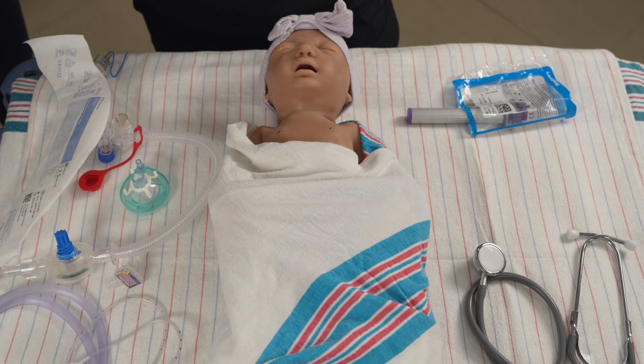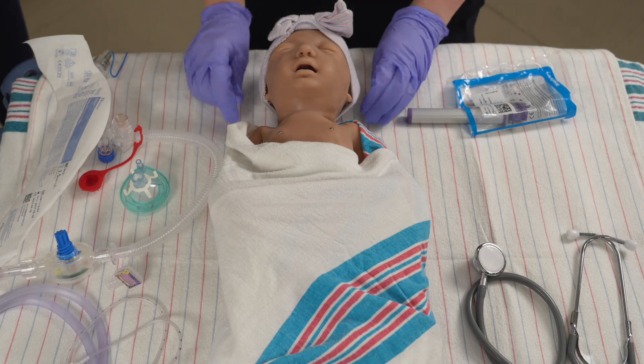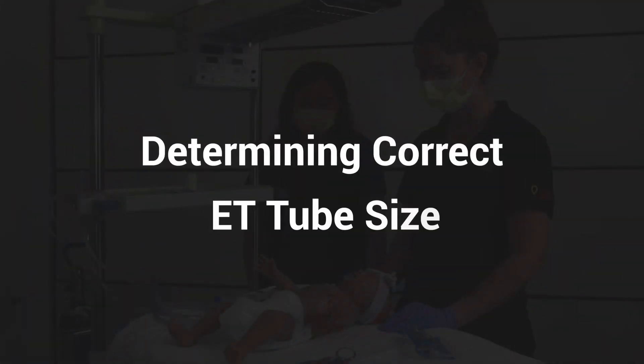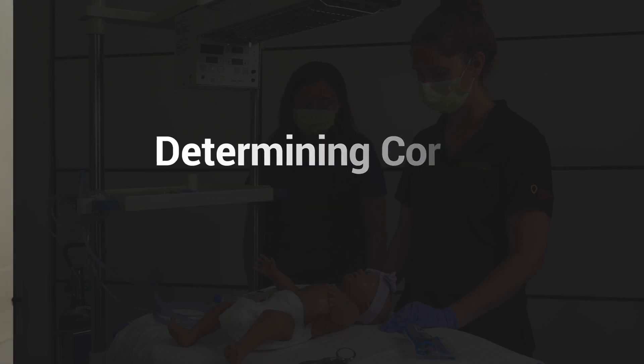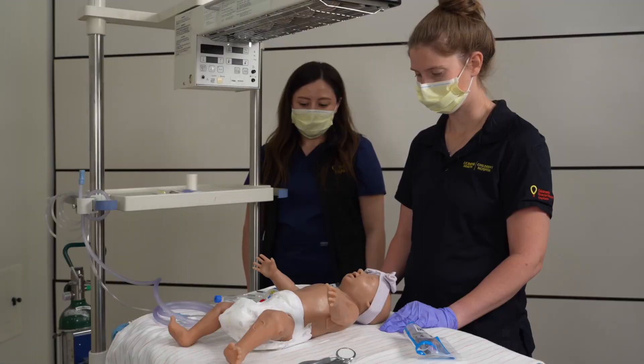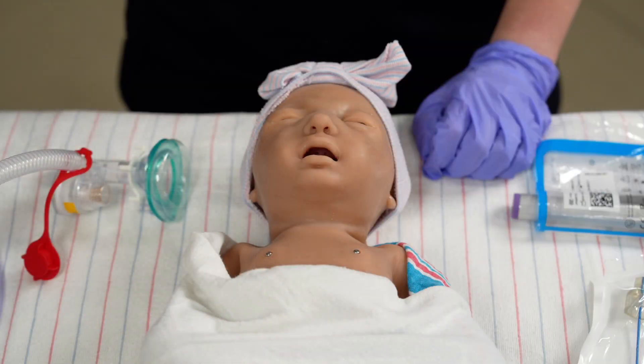You may consider increasing the infant's oxygen concentration to support them through intubation. To determine the ET tube insertion depth, add six to the infant's weight in kilograms. Verbalize the ET tube measurement at the gum or upper lip.